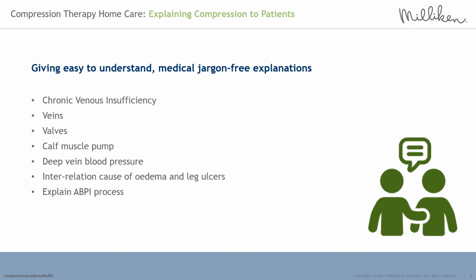A calculation is made from the blood pressure readings, and this gives a number which lets the healthcare practitioner determine how much compression treatment can be used safely and effectively, so how much squeeze is required to support their veins, valves and calf muscle pump to reverse their symptoms and heal their wound.